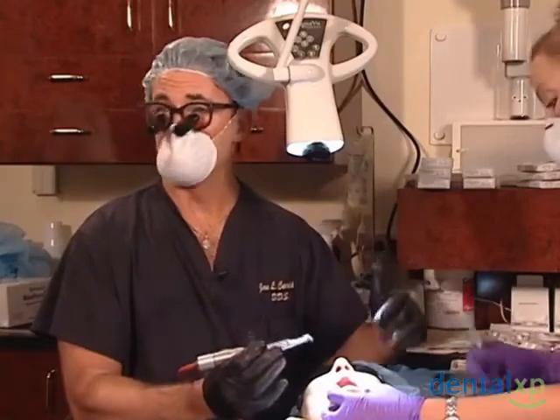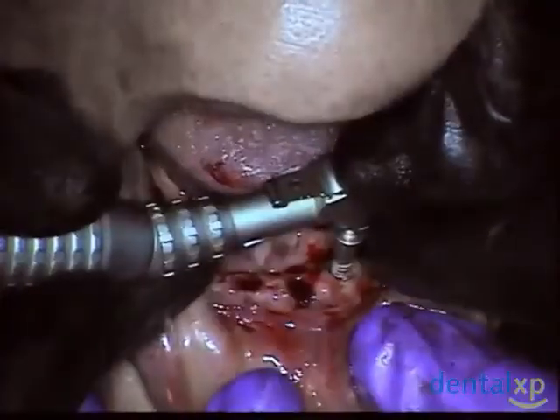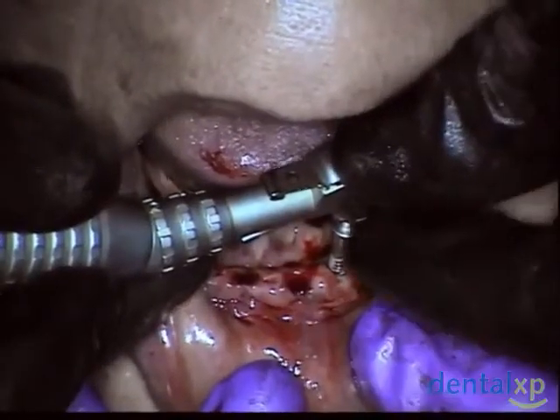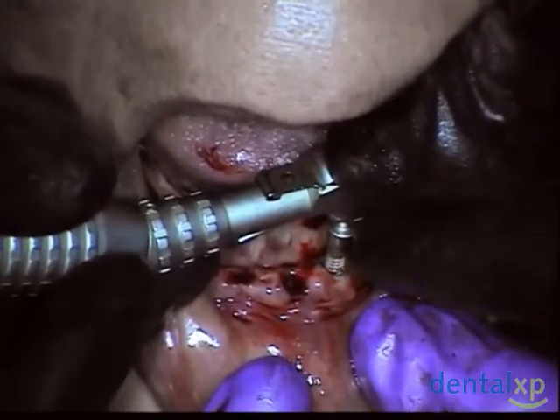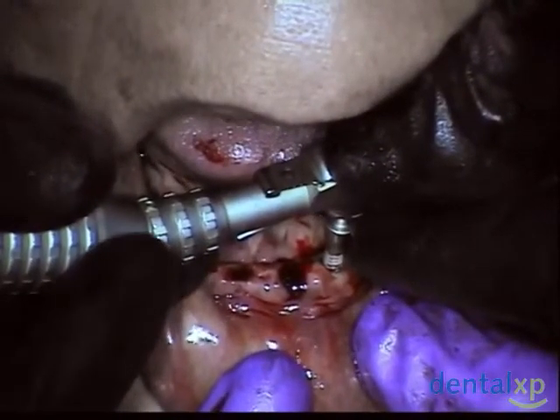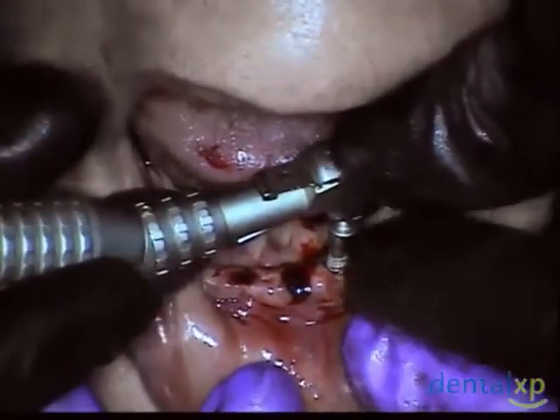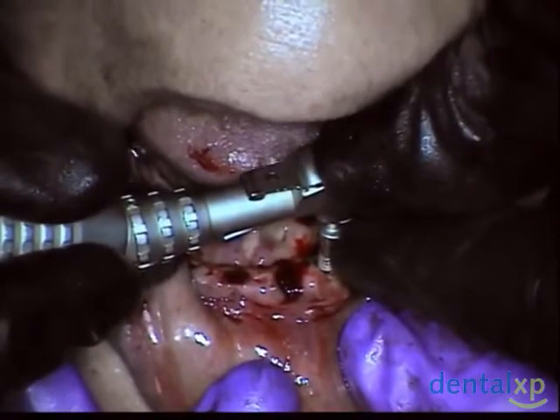I take it out and tap, and I may not tap all the way down. What I'm doing is placing this driver so that it engages the hex. I don't want to start the motor till I know I'm engaged in the hex, because if I do, I will round out the hex, and then it will make it a little more challenging to get my instruments to be of use in driving this into place.